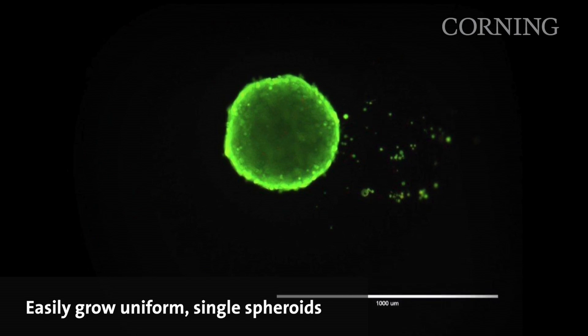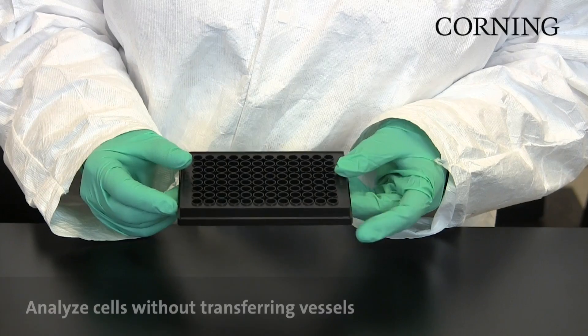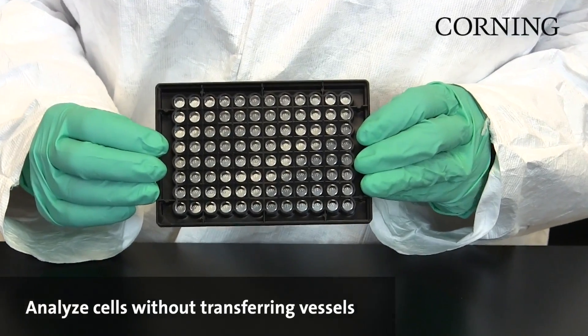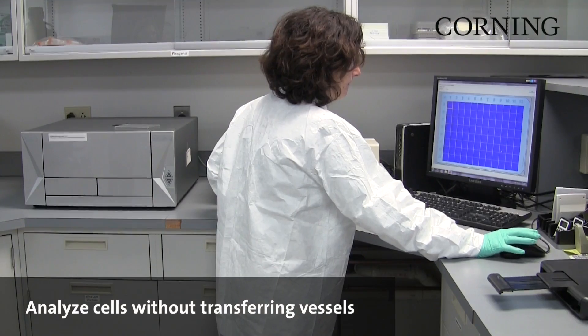The ultra-low attachment coating enables growth of distinct, unattached colonies or spheroids in the center of each well, across all wells. The unique design of the microplate also features black sidewalls which shield each well to block well-to-well crosstalk, allowing you to assay and analyze your spheroid in the same plate without transfer.